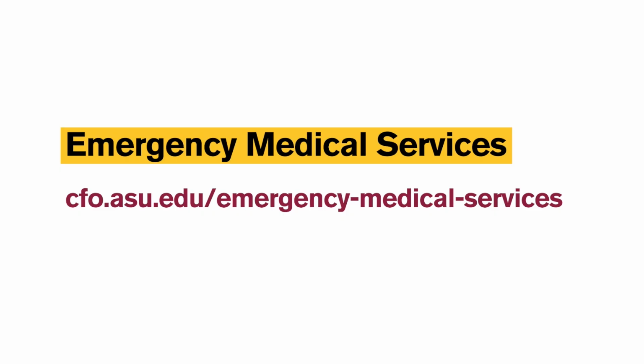If a shock to the person is not advised, continue chest compressions and follow the AED's prompts until emergency medical services arrive. ASU EMS provides additional CPR and AED resources and services.